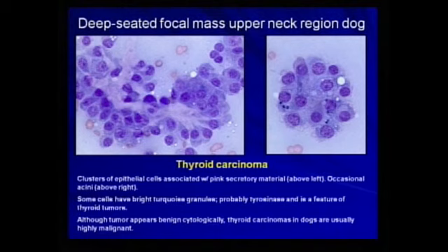Let's put it all together. Okay, we have glandular acinar structures. It's the neck of a dog. The pink material that you're seeing is going to be the colloid. And those granules, you can even see some of that colloid sticking over here. And then those secondary lysosomes, which are breaking down the colloid, will stain positively, very much like melanin, because tyrosinase is part of that complex.